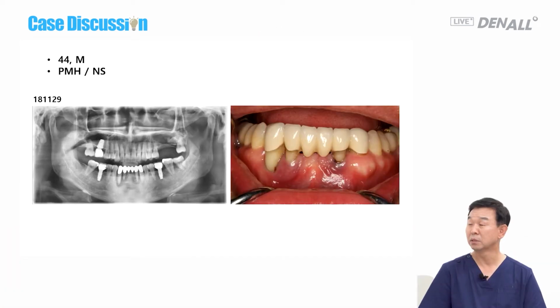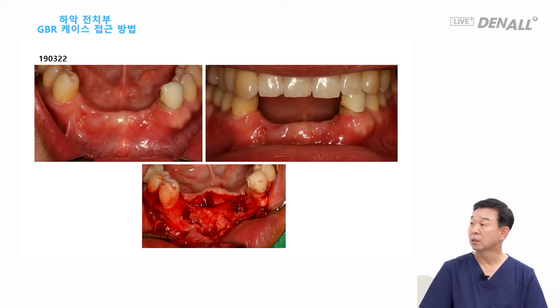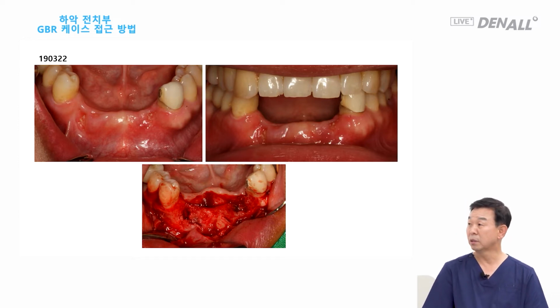I tend to be conventional, so where there is a serious periodontal disease, I extract the tooth. That means there's a lot of bacteria and the soft tissue is not very good. So we wait 2 to 3 months, then the infection would subside and the soft tissue would be healed. So this is a similar case. Teeth are extracted first, and to facilitate the healing of soft tissue, collagen is added, and it is sutured. After about 3 months, soft tissue is healed, and implants are placed together with bone graft.